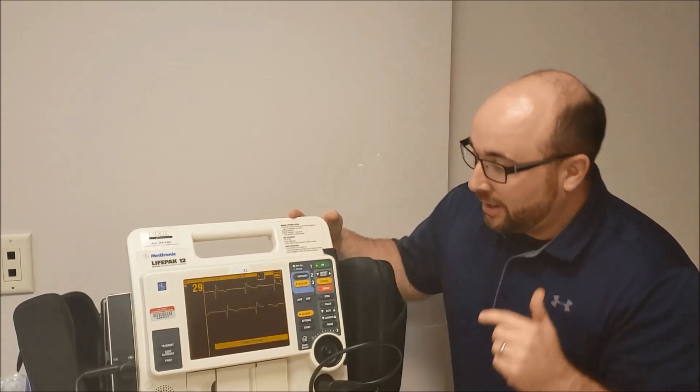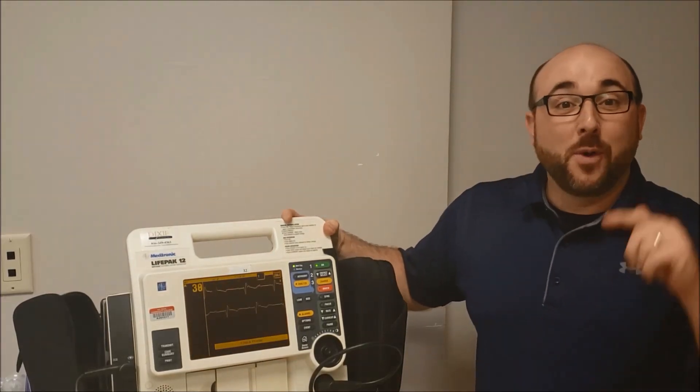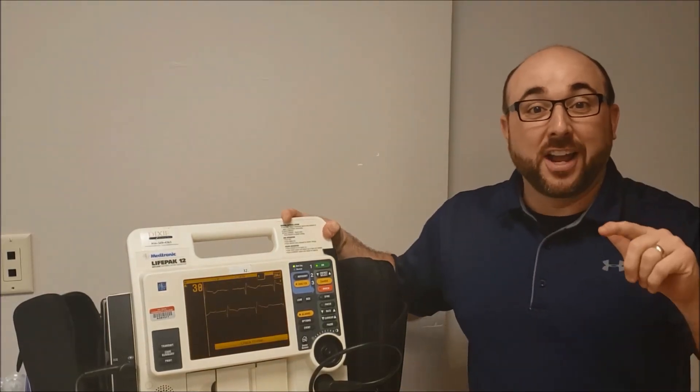What's up today guys? Jimmy from the RT Clinic. Today we're going to do our best to show you a perfect mega code. The monitor's reading 29 — we need to get to work.